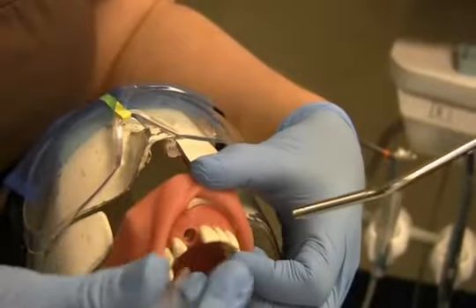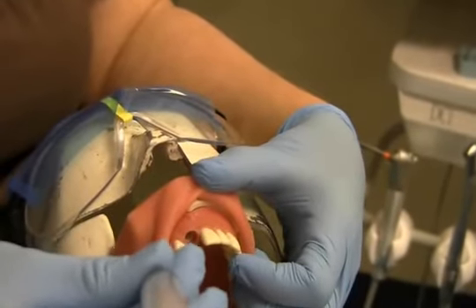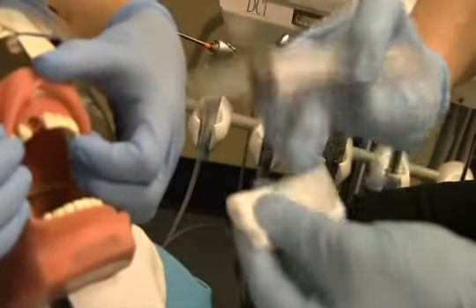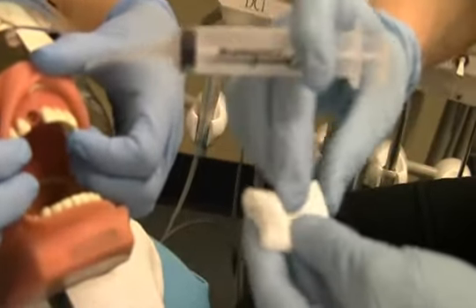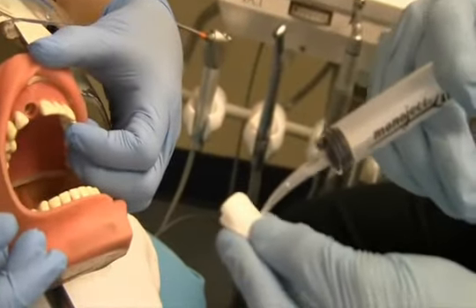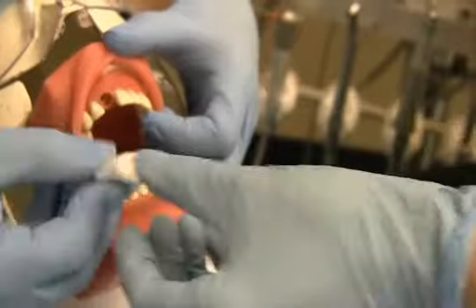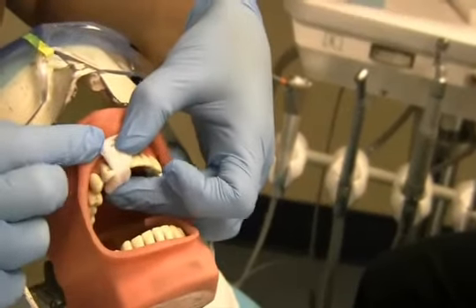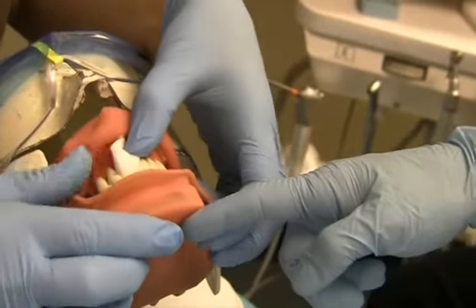The dental assistant would take a 2x2 gauze, moisten it with sterile water, folding it into a little log. We would roll it up and make sure it's moist with the sterile water, then pass it to our dentist. The dentist would then place it around the socket area and have the patient bite together firmly.